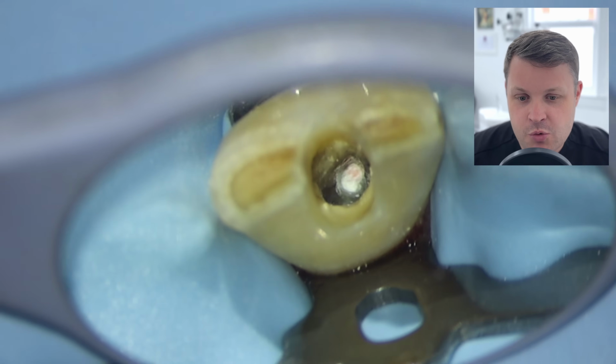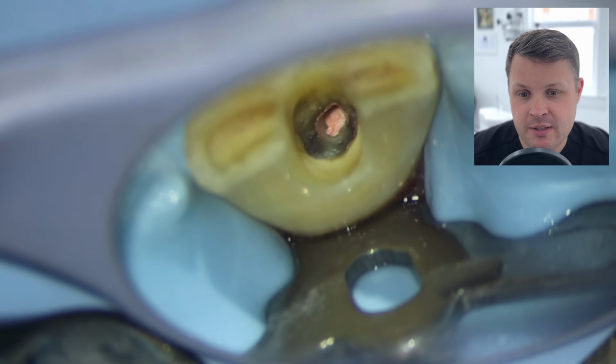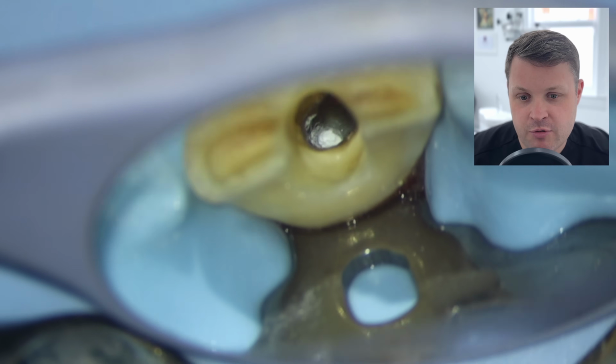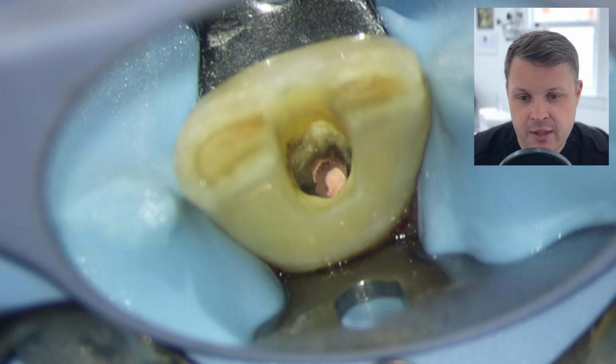So once we've pushed it all down, I'm going to give a bit of a clean out, and then I'm going to use my paper points, and we can see now that we've got a nice obturation, we've got a nice perforation repair there, and everything is ready to be sealed off and ready to go. So I'm very, very happy with this.